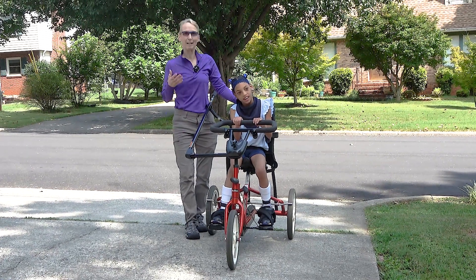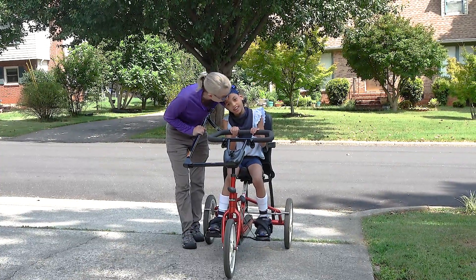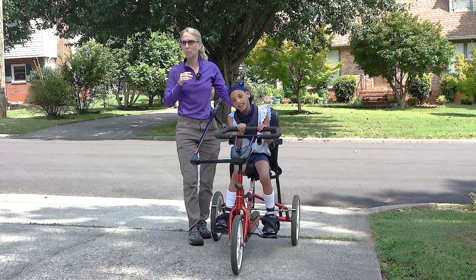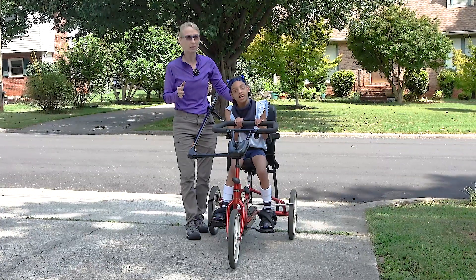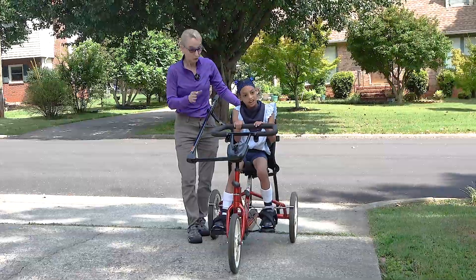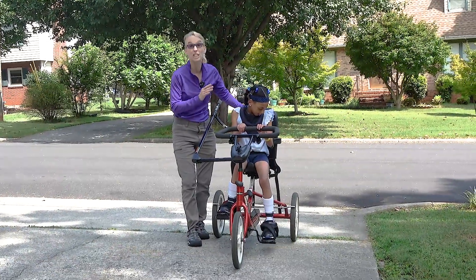Hello, my name is Amy Sturkey. I'm here with Alexis Sanderson. She is nine years old. She has quadriplegic cerebral palsy. She can walk with two hands pretty well, really well with trunk support, or not so well with one hand held. She is on a Riften tricycle, and this introduction better be short because she is ready to go.